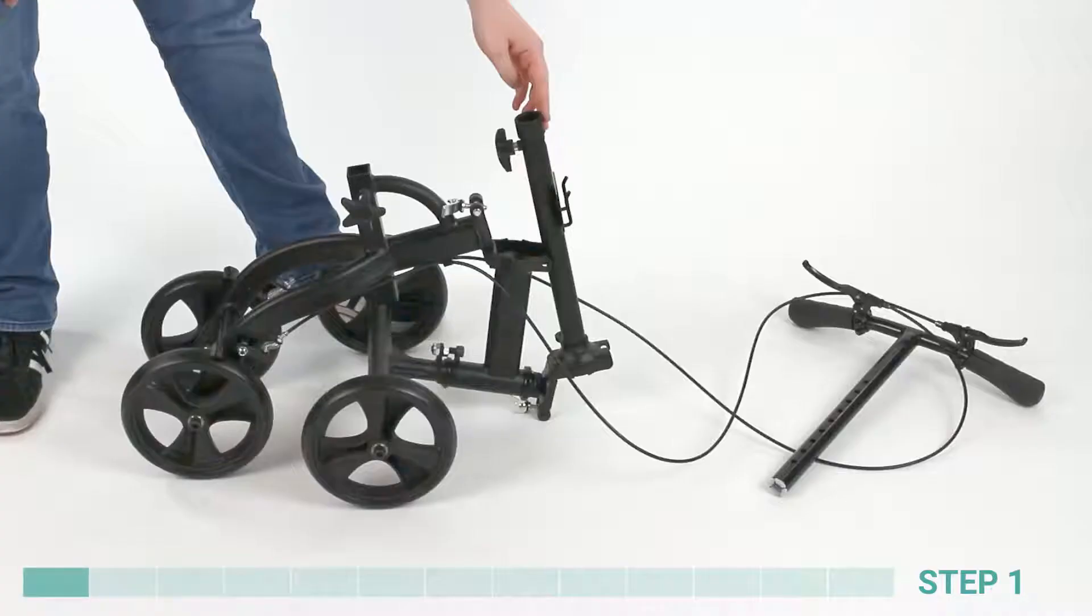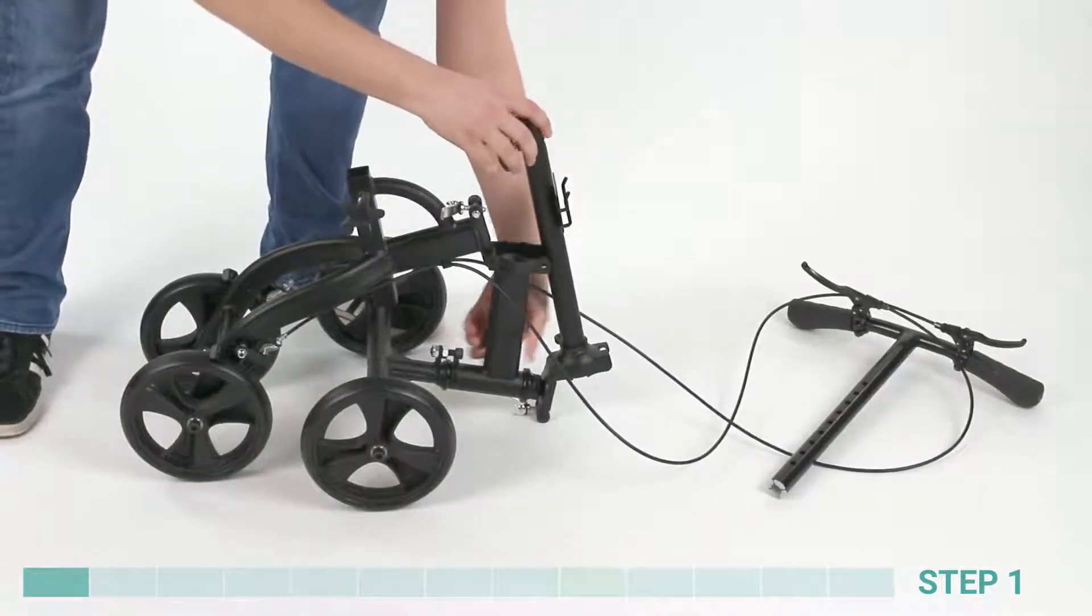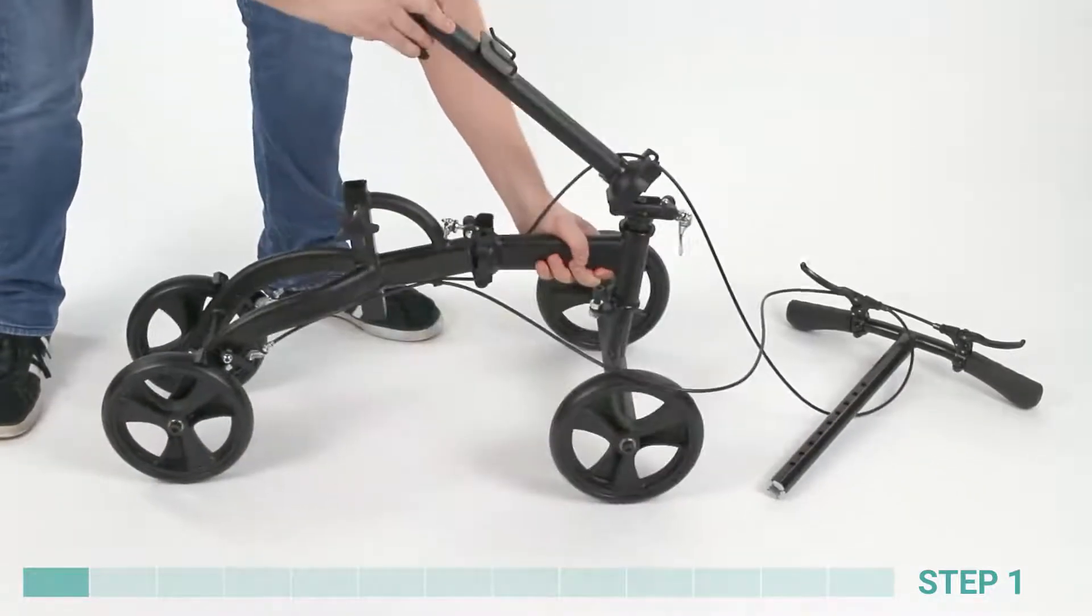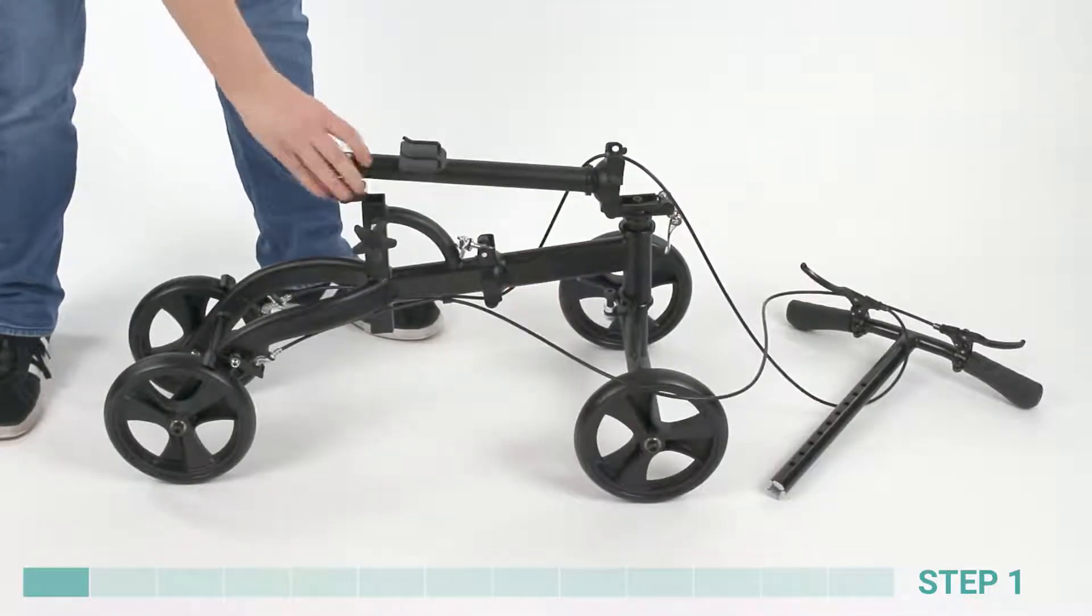Step 1. With rear wheels on the ground, lift the front axle forward until the folding joint between the front and rear axles locks into place.